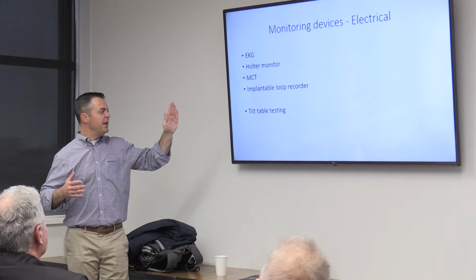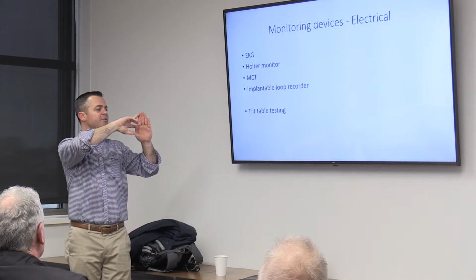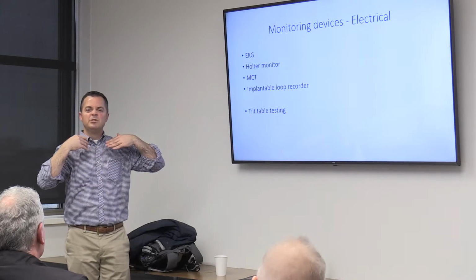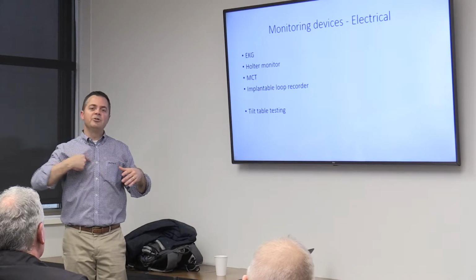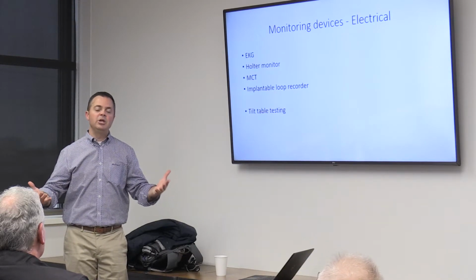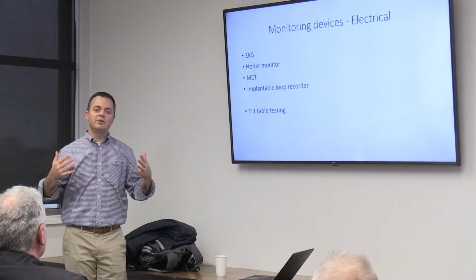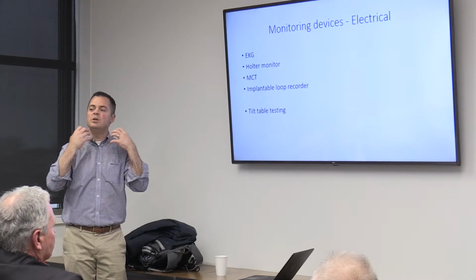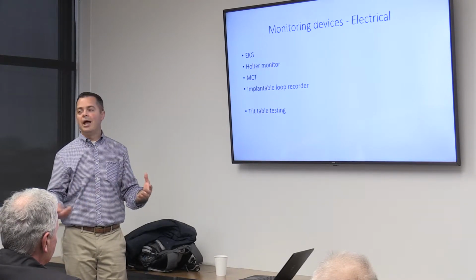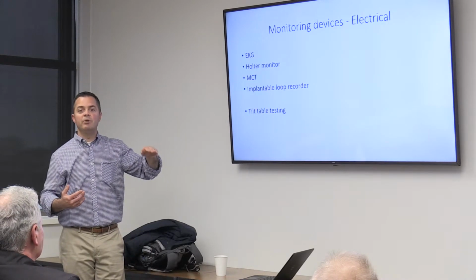You can imagine if you're standing up, your brain's above your heart, and then if you lay down, they go back more even with one another, so blood doesn't have to fight gravity. Your brain and your heart communicate all this. You don't have to think about it when you stand up. You don't have to say, brain, be prepared because the blood's gonna have to fight gravity now, so my blood vessels gotta squeeze a little more. It just happens on a reflex. Well, sometimes that reflex gets screwed up and it misfires. And a tilt table is a way to see if it's that reflex that's misfiring.